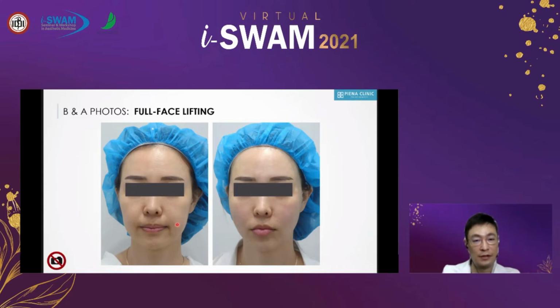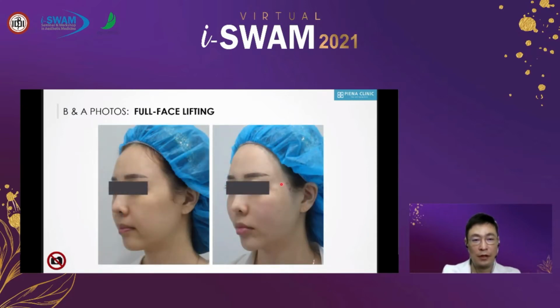I put this in this direction for mid-facial lifting, and also I lifted her eyebrows. After treatment, her facial contour has changed much more nicely, and her eyebrows and upper eyelids are well lifted. Therefore, for some cases, we should consider additional lifting for the mid-face and lower face to achieve a better brow lifting effect. So do not see only a part of the treatment. You should see the whole face, because you should keep the balance even after a focal treatment.